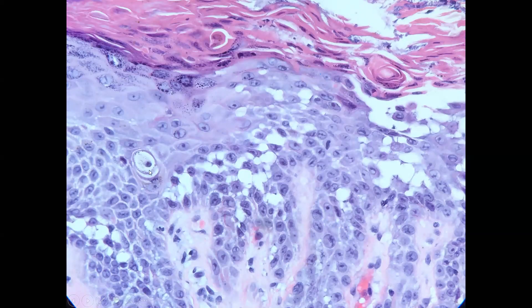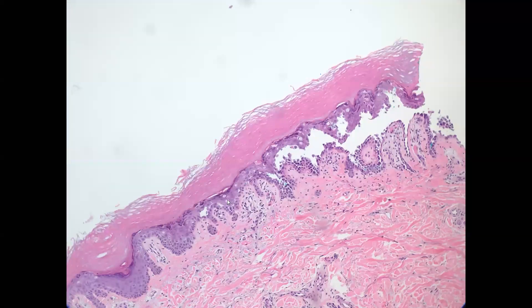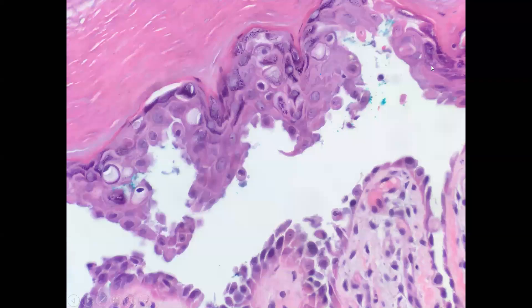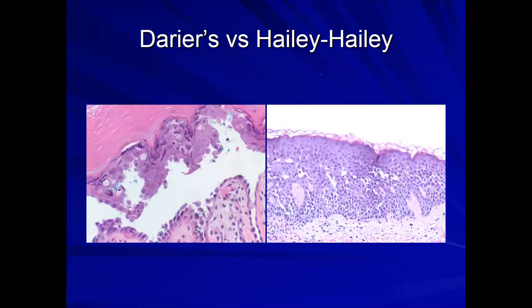Here's a close-up picture of a corps rond: as it matures improperly, it results in funny-looking cells that produce funny-looking perikeratotic grains. Here's a case of Darier's disease with a suprabasilar split that looks a lot like pemphigus, but when you look closely you have this dysmaturation — these dyskeratotic cells — telling you that you're dealing with Darier's. This contrasts with Hailey-Hailey, where the split extends through more layers and there is a lack of dysmaturation.